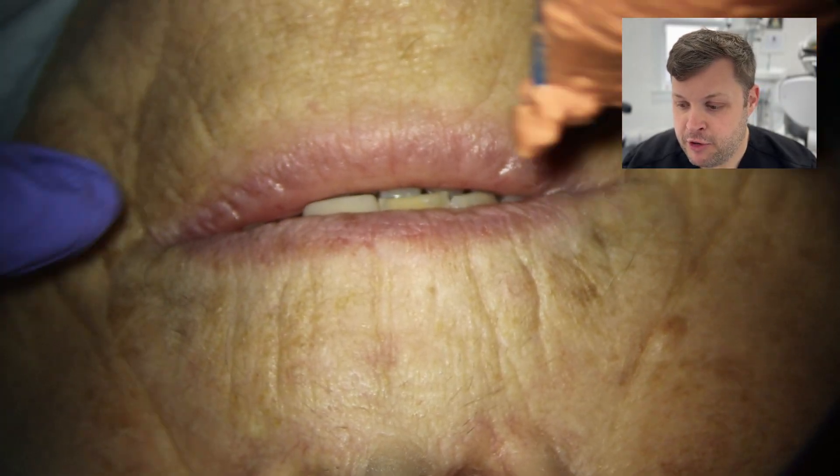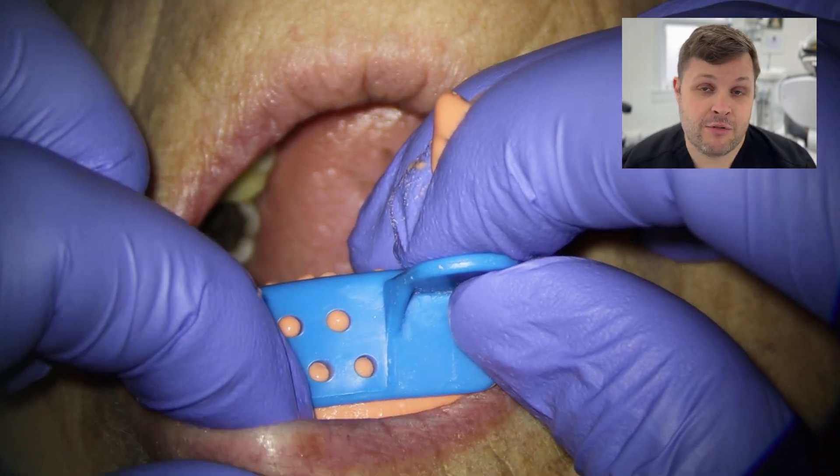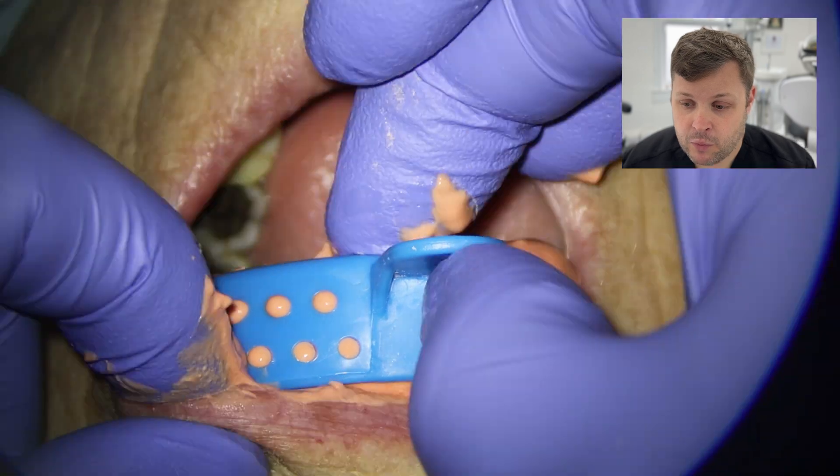The referring dentist had asked me to do a few more steps than I would usually do — they've asked me to do the root canal, check restorability before that, and also place a post if required, plus a provisional crown. So the first thing we want to do is check the restorability of this tooth, and to do that we're going to have to take the crown off.